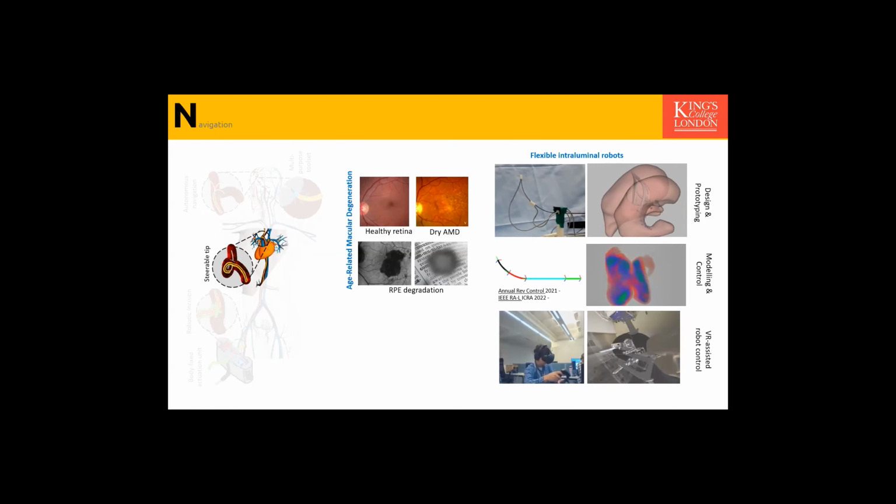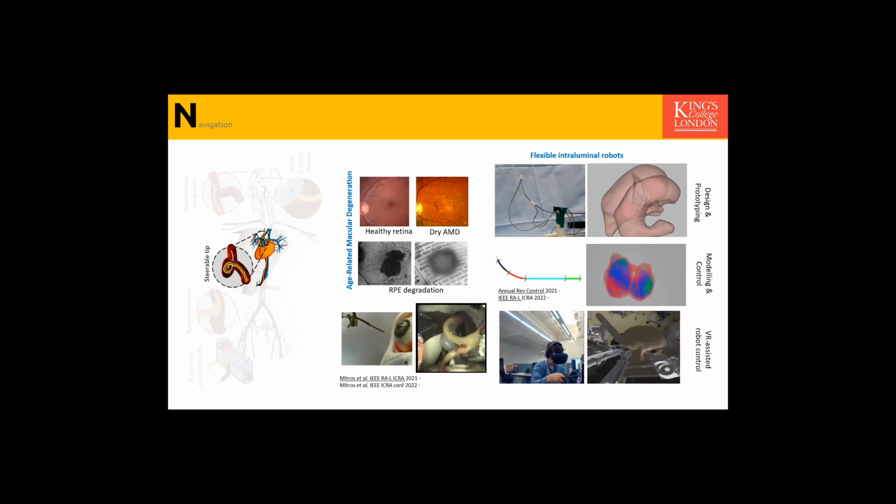But okay, how would steering a catheter match or relate to a concentric tube robot? The idea is the combination of the catheter and guide wires are already concentric tube robots, and surgeons are actually bending the tip of them based on the task that they want to do. So unintentionally, they're actually using these systems as a concentric tube robot.